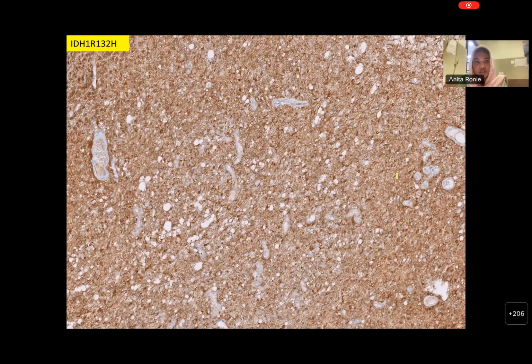So ATRX, Abhirami, you were trying to tell something. You want to correct it? What Shreya told: if you see any loss of nuclear expression, it means that it is of astrocytic lineage. So diffuse, more appropriate, Shreya. What Abhirami said was right. It's not that the retained expression is more informative.